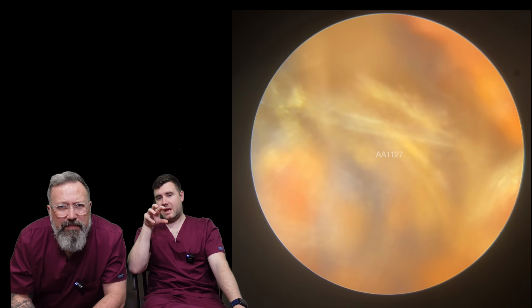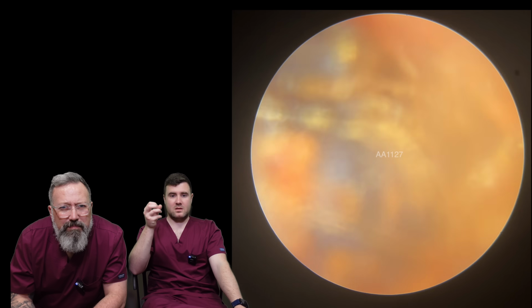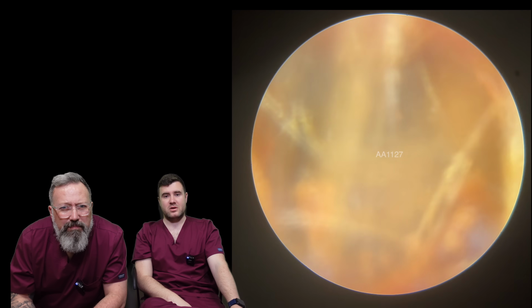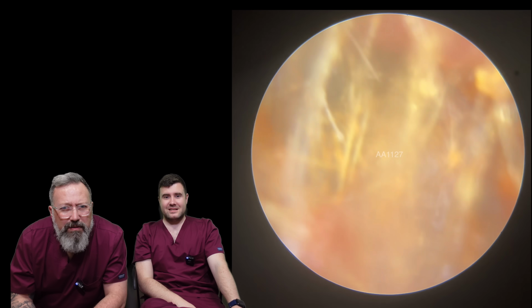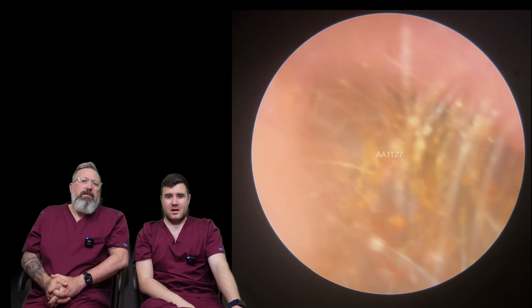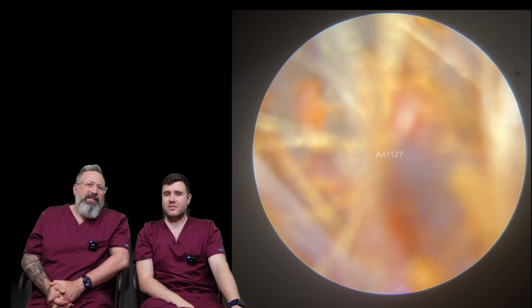But this is why we hate the hairy ones, because even if there's a small amount of wax on one little hair, if you manage to catch it, it just obscures your vision completely, and you're back and forth wiping it every 2 minutes, or every 2 seconds, I would say. That's almost there, isn't it? It's on its way. Apologies about the vision on this one, guys. It's quite a dense amount of hair, isn't it?